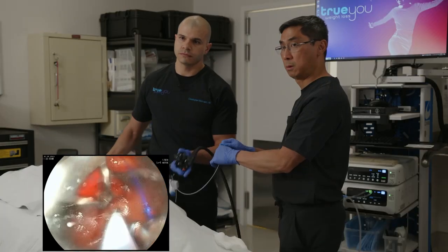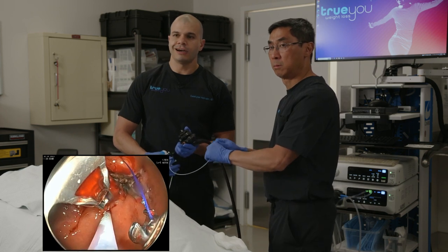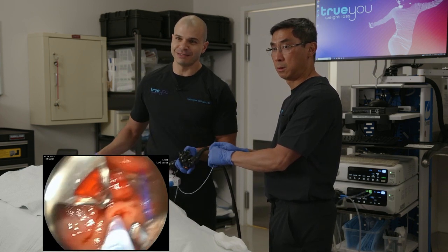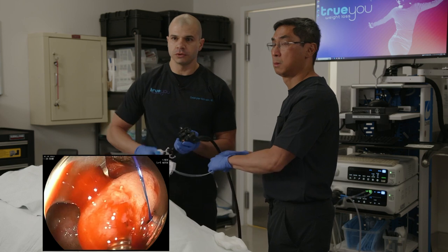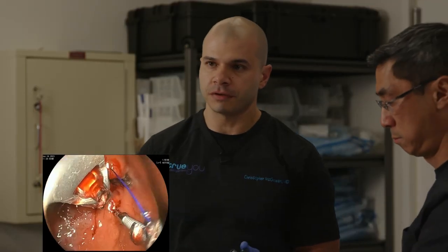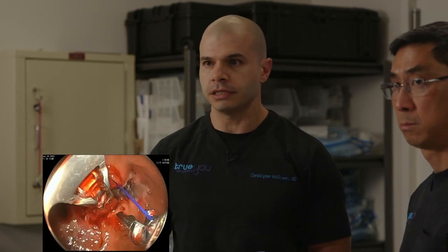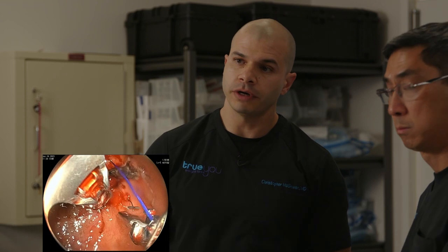Mark on Facebook wants to know, what do you think her total weight loss will be? As far as what she'll lose, again, it's largely dependent on the individual. But I would speak to the averages. I know that on average she'll lose 17% of her body weight. And so I would expect that, assuming she's working closely with our team, that's the average I would expect. We'll go ahead and cinch here.